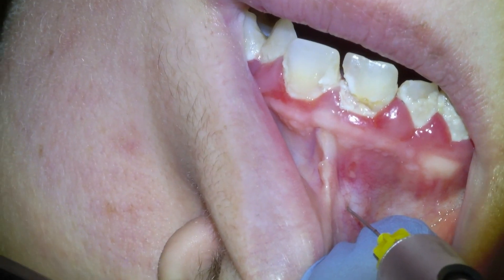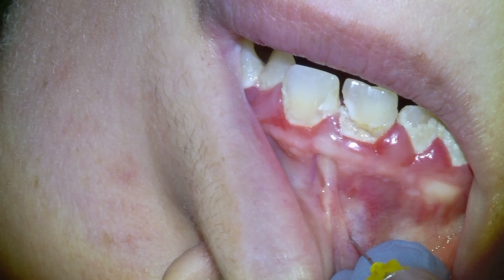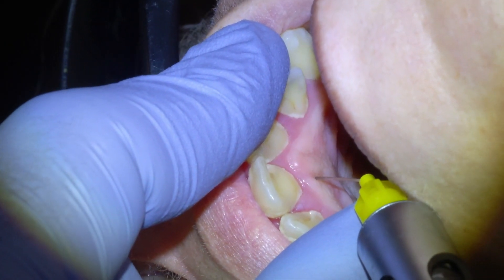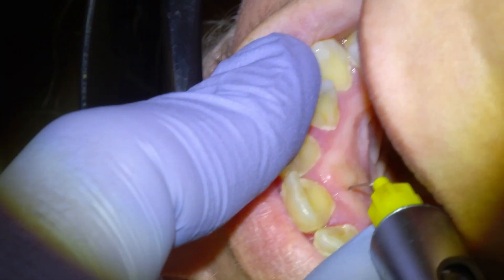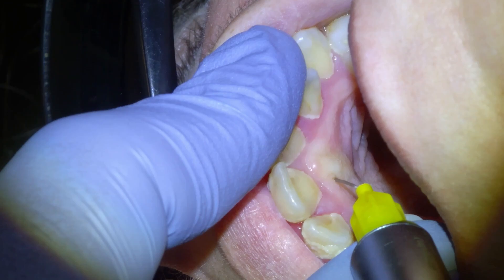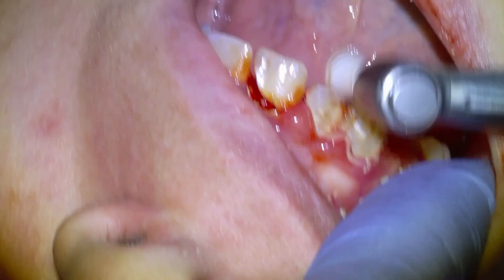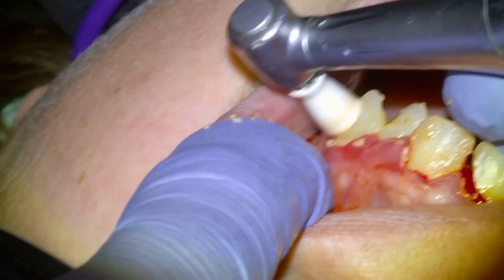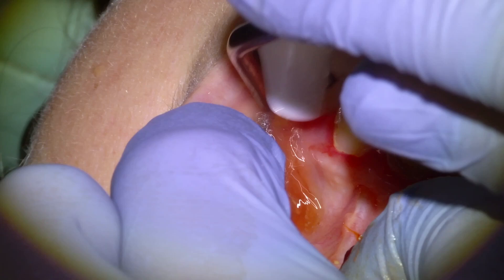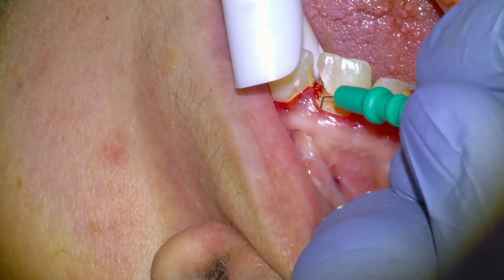We're going to go in and freeze the tooth on the cheek side and then a little bit on the palate. This patient knows that their oral hygiene is inadequate — the gums are red all over the place, lots of plaque buildup. This patient needs to see a hygienist every three to six months and really start brushing twice a day with a high fluoride toothpaste and flossing daily. I'm going to remove most of the plaque from the surface using a polishing cup and some pumice to give us a cleaner operative field.